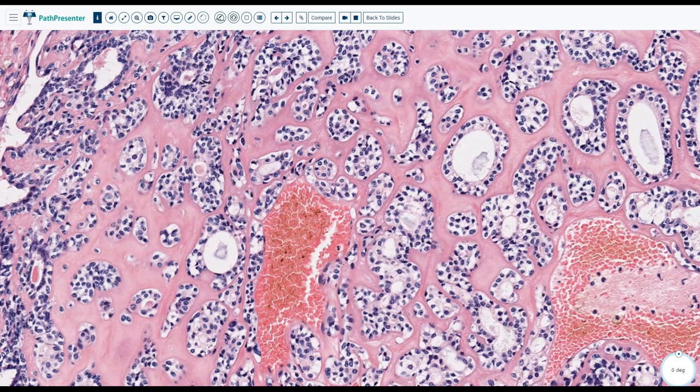Do you think, guys, it is a common or uncommon tumor? Yeah, it is very rare. It's around 1% of all salivary gland tumors. Very rare. I've seen in the last 2 years two cases of epithelial myoepithelial carcinoma. They are not that common, and I do a lot of head and neck. So basically, you'll see two components. You'll see cuboidal columnar cells, clear changes.